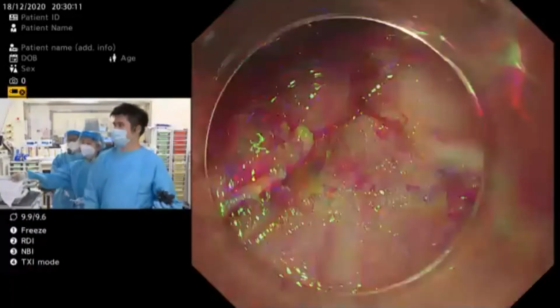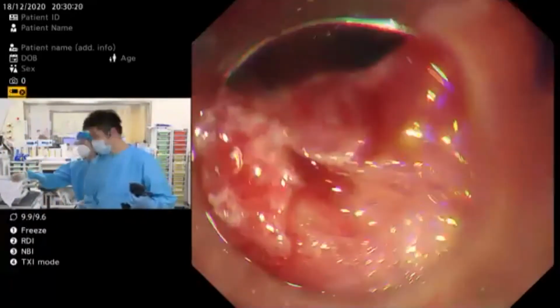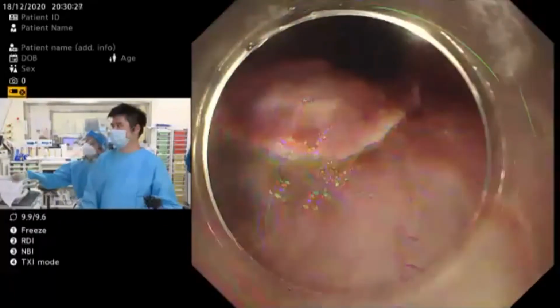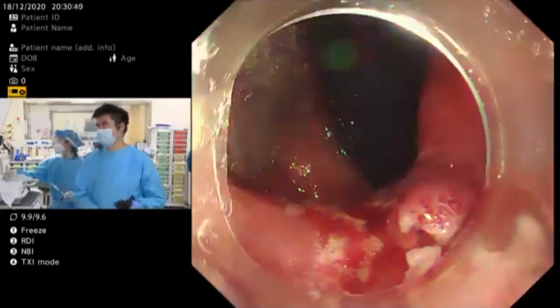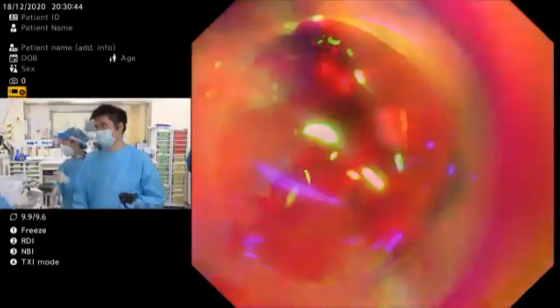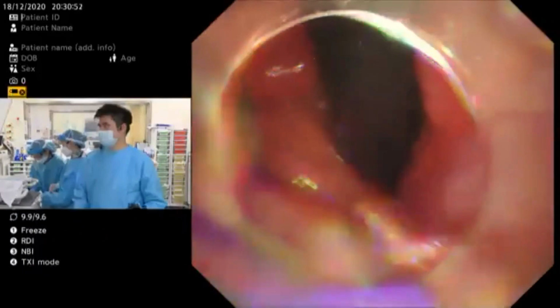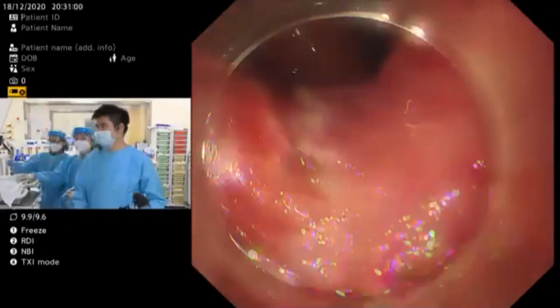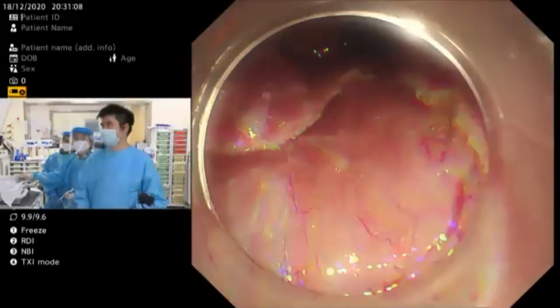This looks like a relatively smaller lesion, but can you comment a little bit for us on the pocket technique? Like when do you decide that I'm going to make a pocket, or whether you're just going to use the circumferential incision and take off the central part later on? To be honest, for gastric lesion, I think there is not a common indication for doing the pocket creation, because even if the lesions are large, there are always ways to mitigate through the submucosal layer and also achieve a retraction. For example, the use of clip line traction. But I think a pocket creation is particularly useful for colonic lesion, especially if it's located in, for example, the transverse colon, and if there is a difficulty in achieving a stable scope position, then those are situations when you should consider a pocket creation.